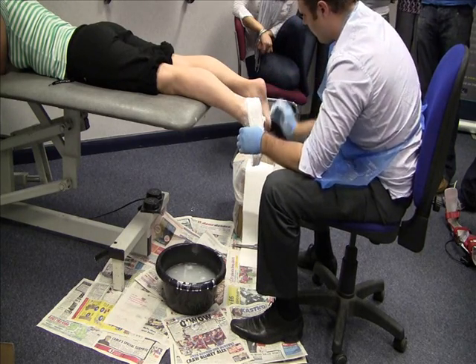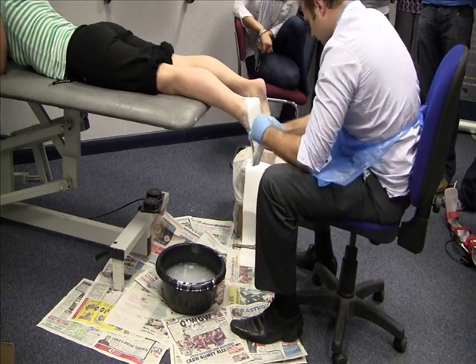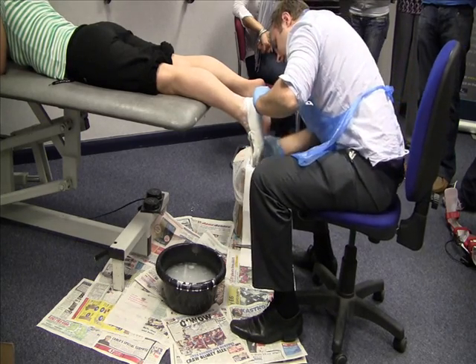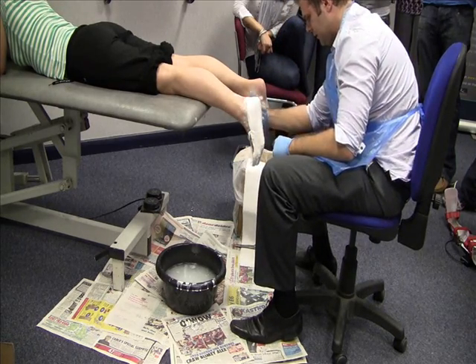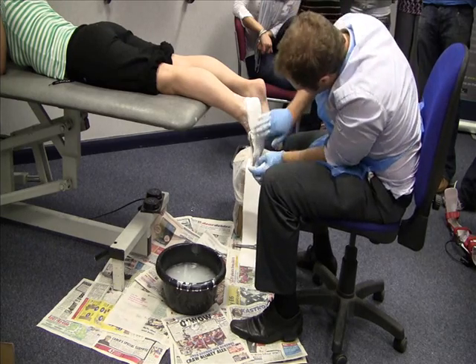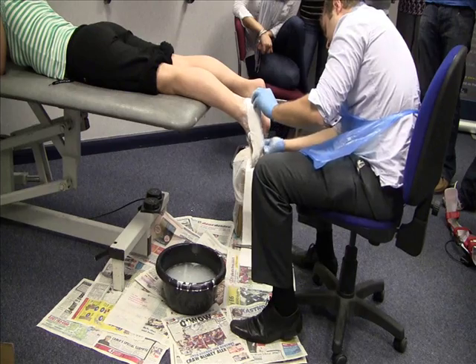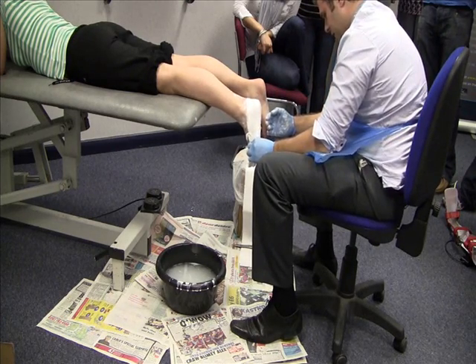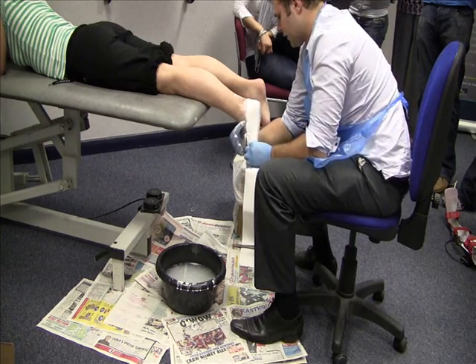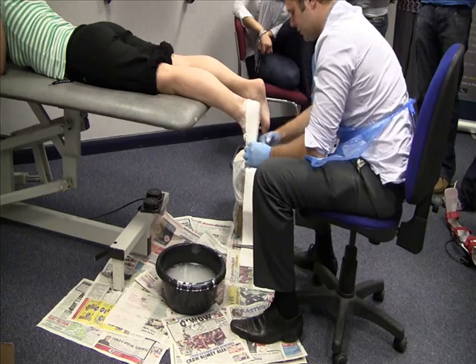You've got a bit more time to play around with this material. Wipe off any excess. Make sure that you've got a nice smooth cast. Sometimes you get an air bubble in the arch — just make sure that's out. If you wipe off the excess, it will dry quicker. Then we're looking to the fourth and fifth. Come round, find neutral, and hold.